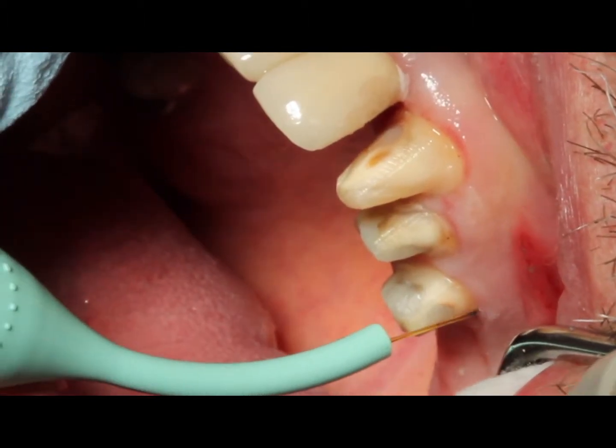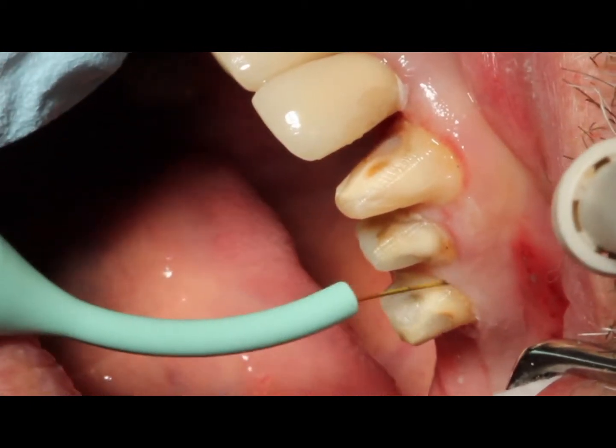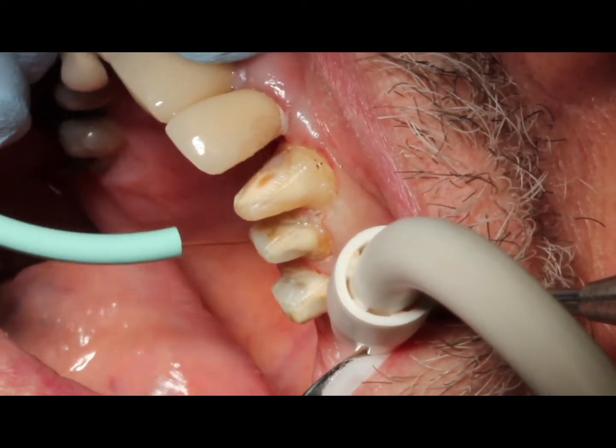When we go to the actual clinical procedure for troughing, we're going to be at about 0.6 watts. You might be varying your power a little bit depending on the consistency of the tissue and the amount of bleeding.